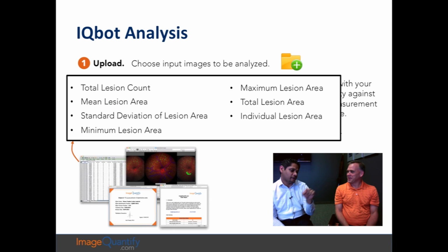Yes, and so it's finding where all the lesions are. And once you've segmented the lesions, you can count how many there are. You can count how big they are. You can measure how intense they are, and you can generate a massive Excel sheet with a bunch of numbers in it and then plot histograms, which is the most valuable way of generally looking at it. Okay, so the output is generally kind of histogram based.